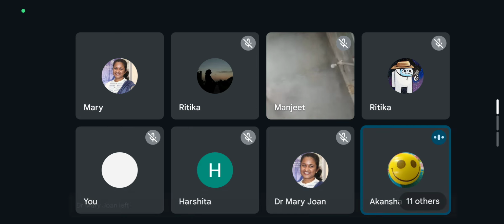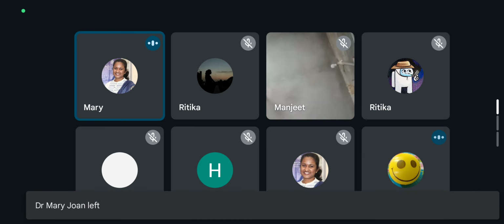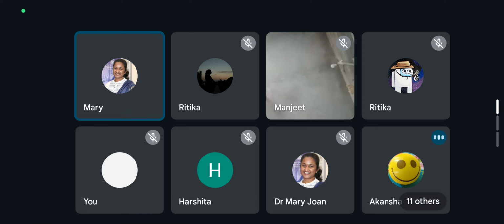Ma'am, dual energy CT, you will not teach us? Yes, I will. Okay, ma'am. Then image rendering techniques and CT perfusion and CT diffusion, they are also part of recent advancements in our CT? Yes, we will see those also. Okay, ma'am.